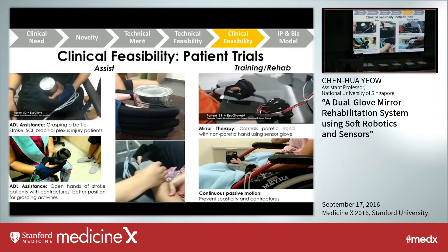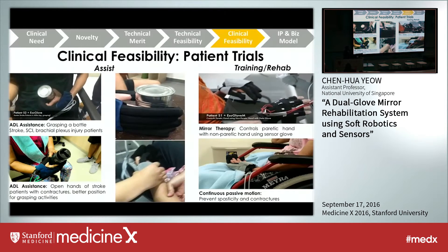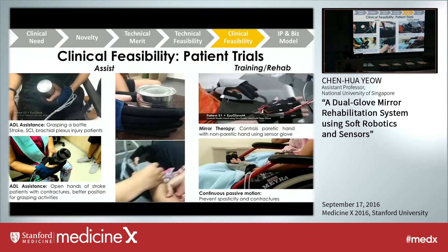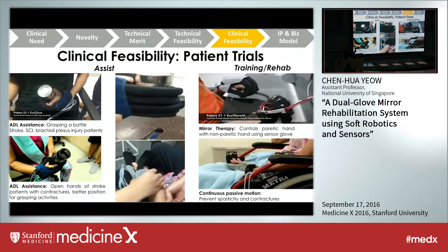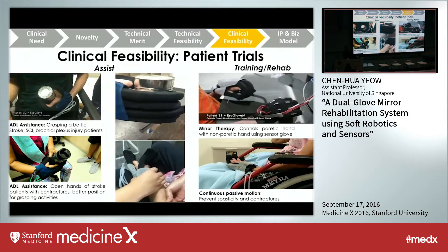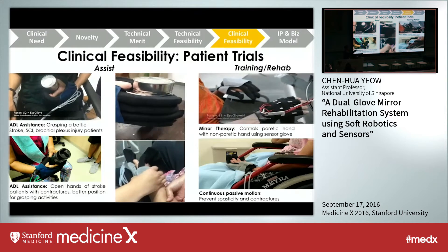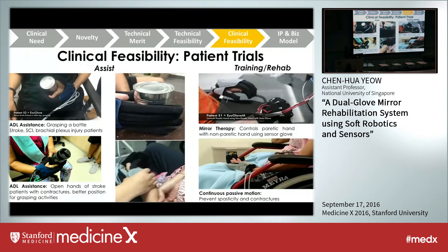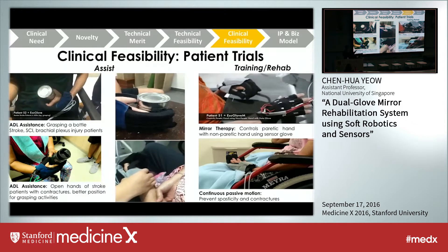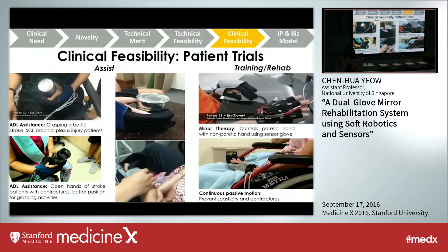We also conducted clinical trials on patients with stroke, spinal cord injury, and brachial plexus injury. As seen in the video, patients are now able to grasp a bottle or can. We are also able to help stroke patients with severe contracture open their hands so they can reposition and perform grasping activities. The glove can also provide continuous passive motion to continuously exercise the stroke patient's hand to prevent spasticity and contractures. The mirror therapy video shows a stroke patient who suffered from stroke three years ago now controlling his left impaired hand with his right sensor glove hand.